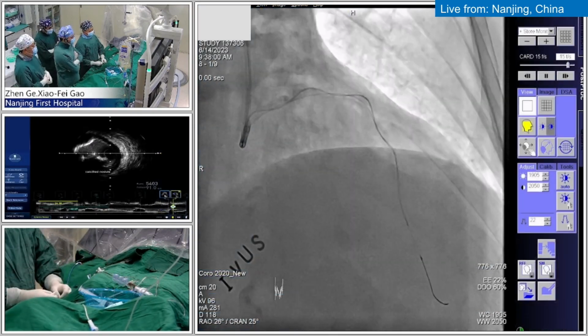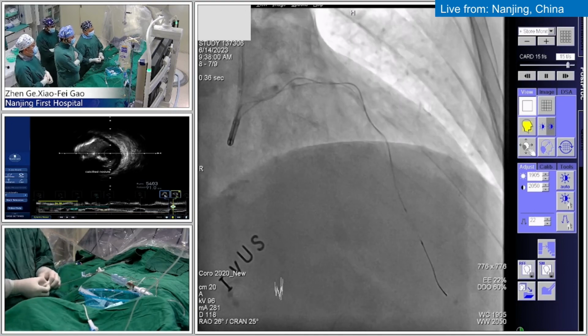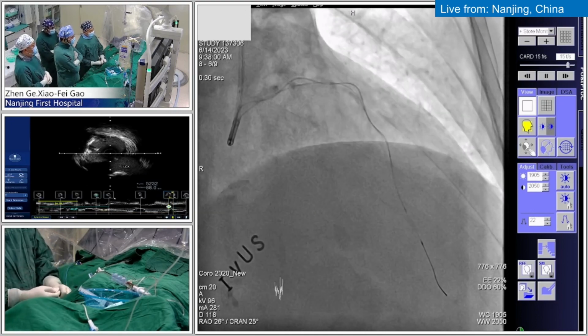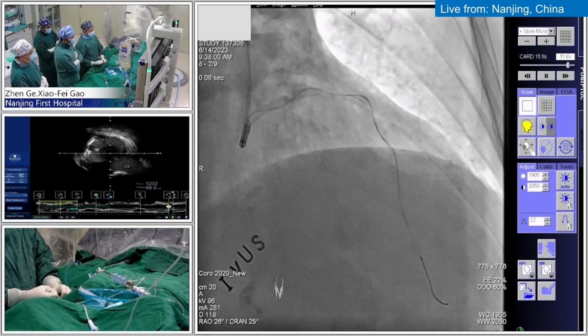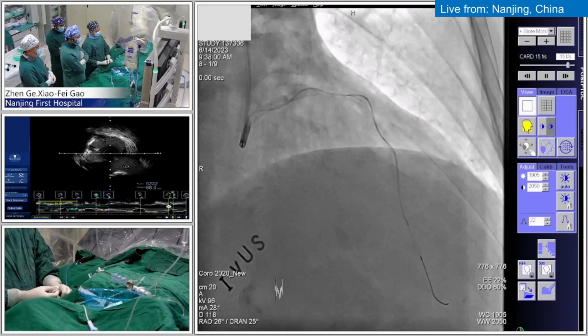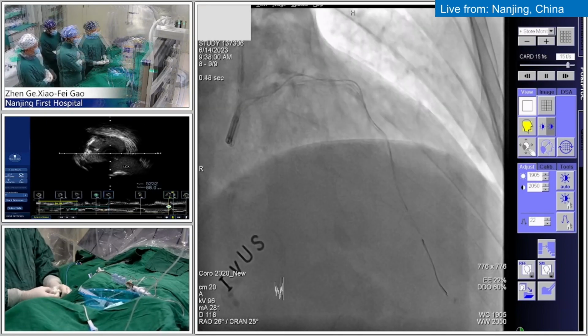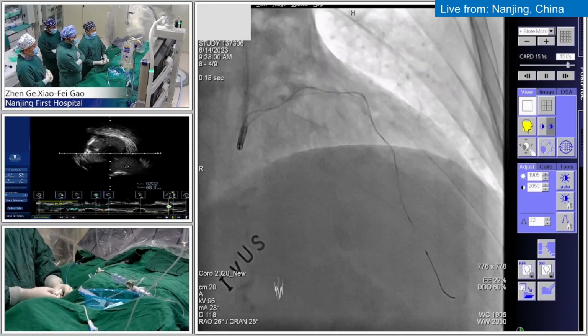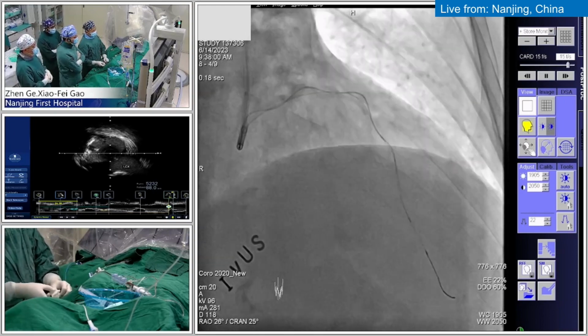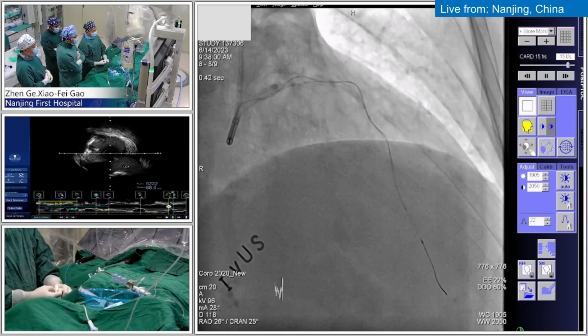So I completely agree with what you mentioned, that an imaging-guided approach, possibly using rotational atherectomy and also using IVL, would be the best way to get the vessel prepared for stenting. Diffuse calcification, severe involvement of the bifurcation site. I like your plan of having intra-aortic balloon pump standby.